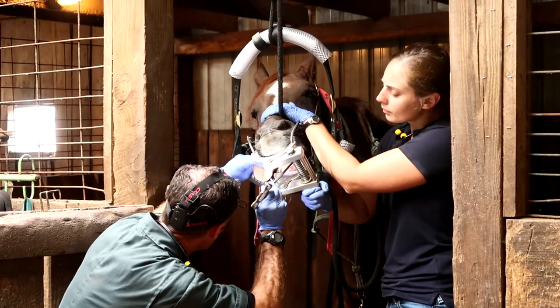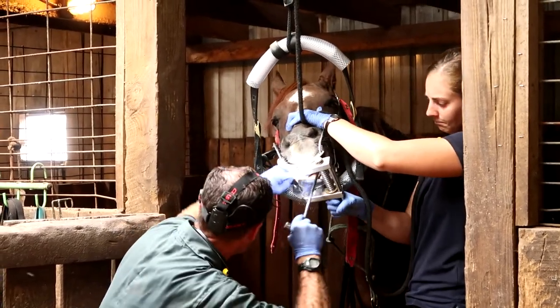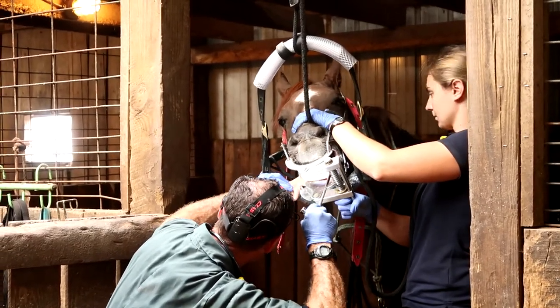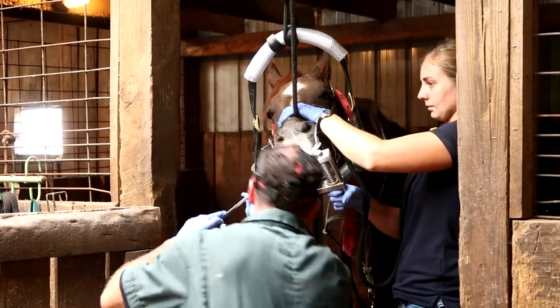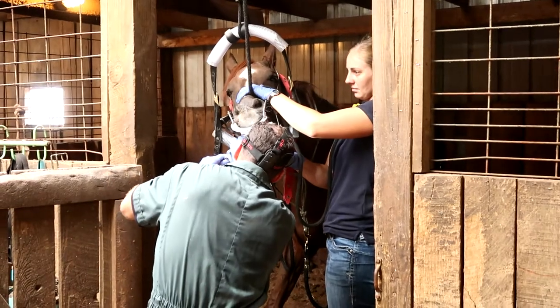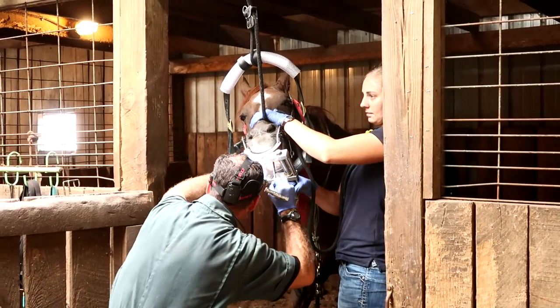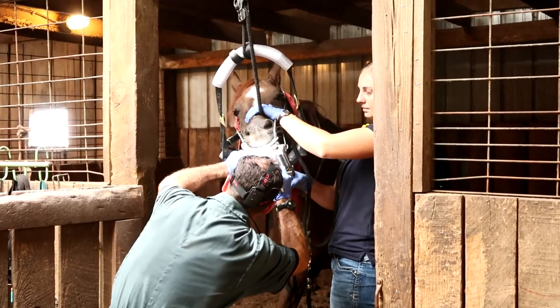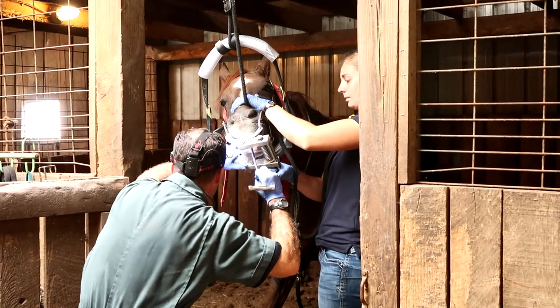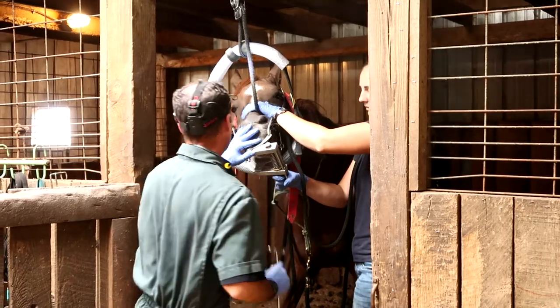This might sound silly, but if you've been to the dentist, I go every six months to get my teeth cleaned and checked. But with the exception of the pulley and the actual float — which is the part that grinds the horse's teeth — a lot of the tools that Dr. Scott is using are the exact same type of tools your dentist would use, just on a bigger scale. Like the mirror to look around inside his mouth, and the little tool that pokes at his teeth to check for decay.